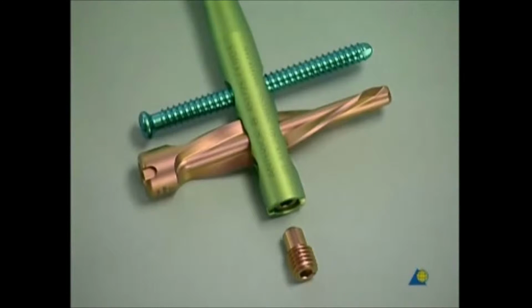In patients with fractures in osteoporotic bone and fractures with an extended supracondylar comminution zone, spiral blade locking is recommended. A more stable retention is achieved through the larger contact surface of the spiral blade, which allows a better distribution of the axial load exerted on the condyles. For this method, a spiral blade, a 6 millimeter locking screw, and a pink end cap are used.